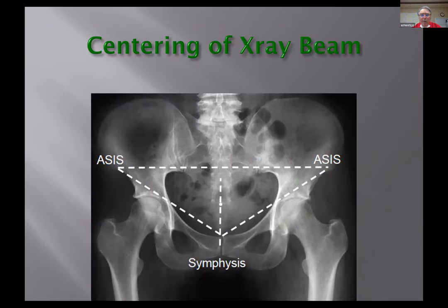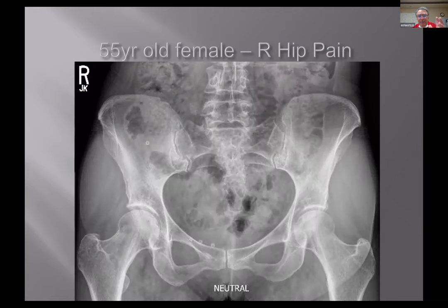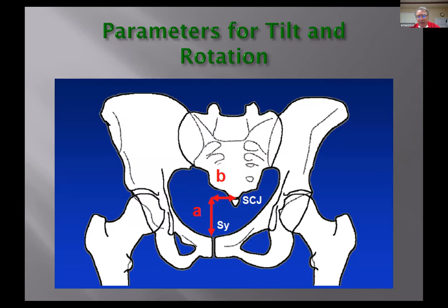So what we want to do is say, look, does someone have a good looking hip? How do we tell? Well, we get a good x-ray to start with. And an x-ray that's centered, you'll see both femoral heads, you'll see the obturator foramen below, and you'll be able to get a good view of why somebody has hip pain. We don't want the end of the coccyx or the end of the sacrum to not be above the pubic symphysis. Otherwise, it throws off the wall geometry.